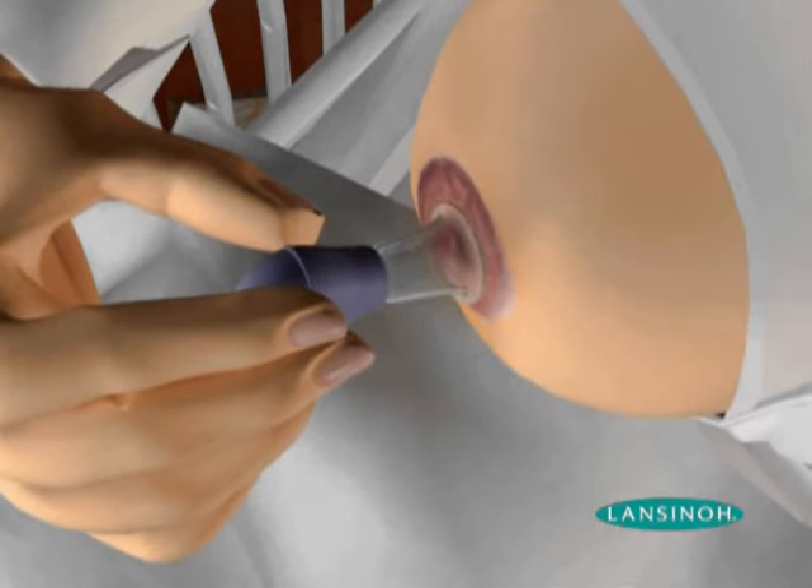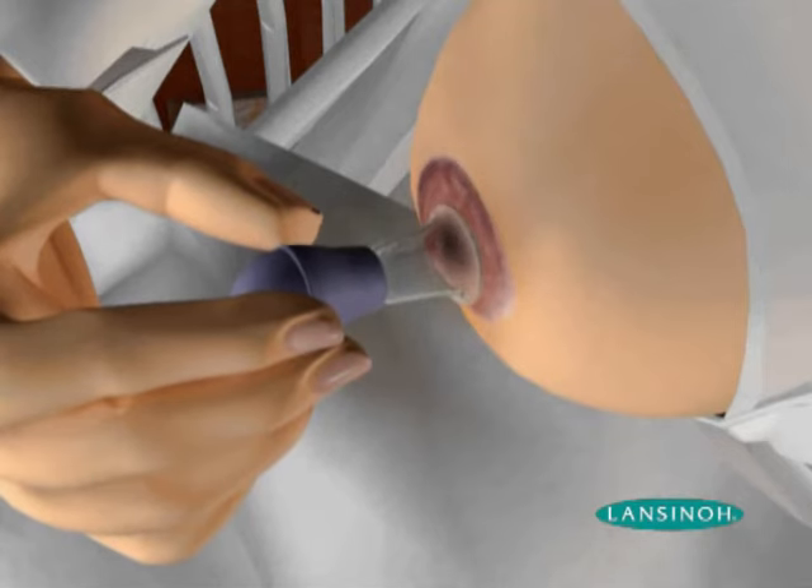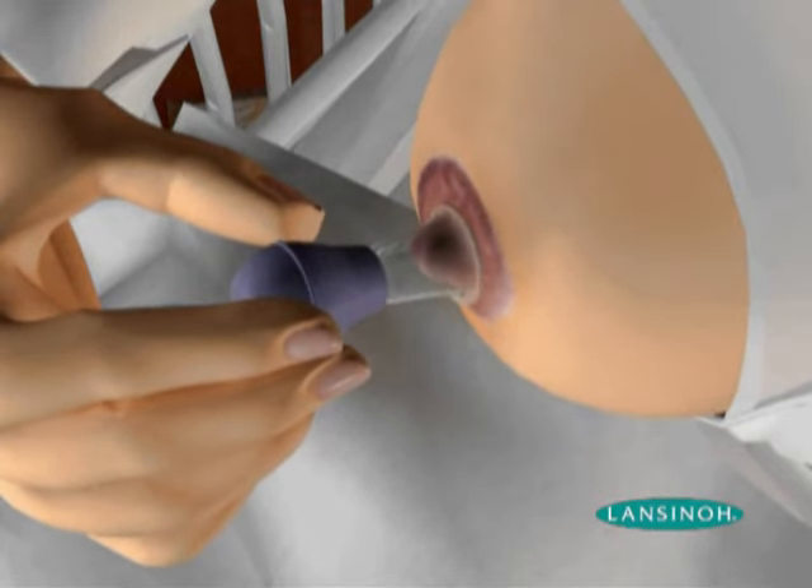This is helpful to push back any oedema or milk accumulated in the breast. Slowly release the bulb for the desired suction and pressure. If needed, squeeze the bulb to break the suction and repeat the process gently until your nipple is extended and your baby can easily latch onto your breast.